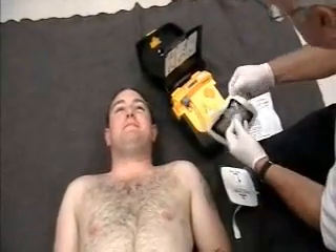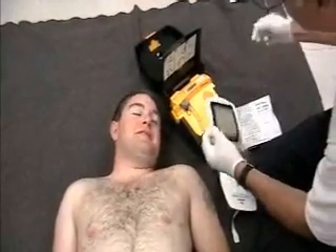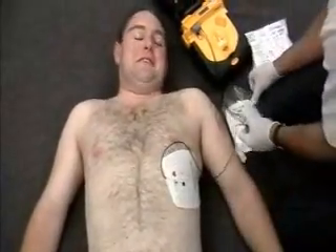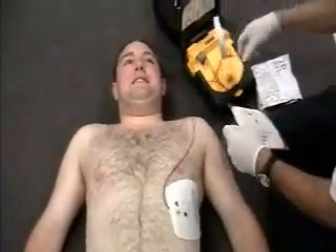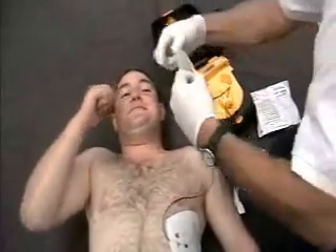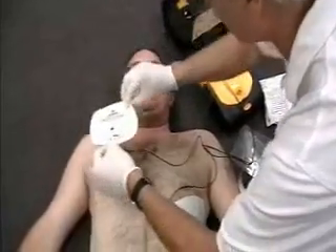I'm getting out the pads. The device says: 'Look at pictures on pads.' I'm going to follow the instructions. 'Peel one pad off blue plastic. Apply pad to bare skin, exactly as shown in the picture. Press pad firmly. Peel other pad off blue plastic. Apply pad to bare skin, exactly as shown in the picture.' That one's going to hurt a little bit. 'Press pad firmly.'